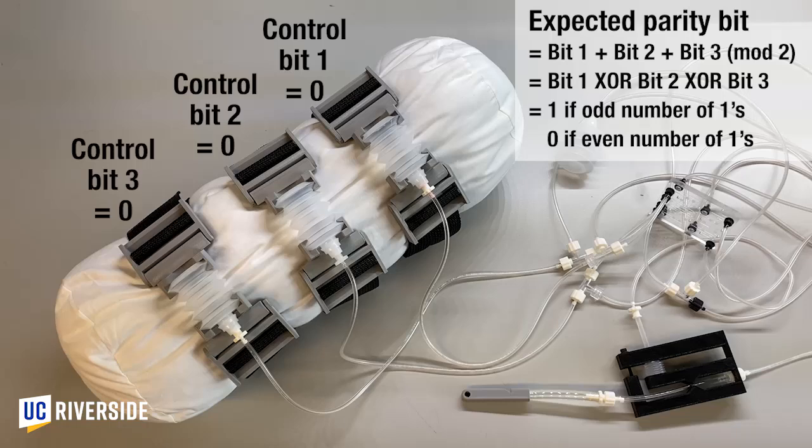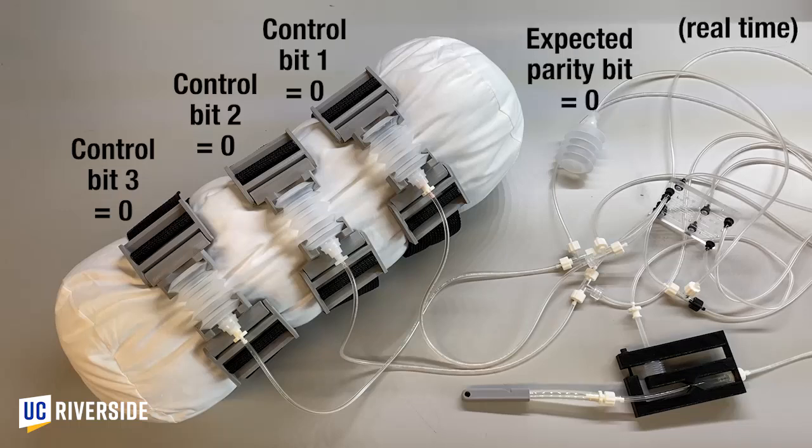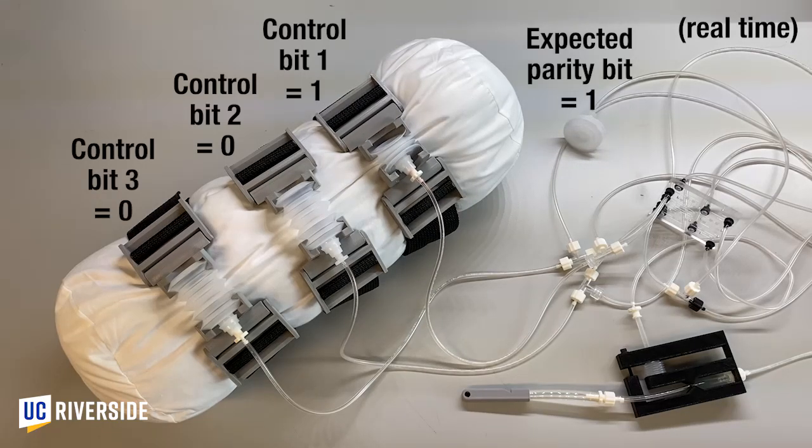We added a 4th bellows, shown here, to visualize the value of the expected parity bit during operation. When none of the IPC bellows are receiving vacuum, their control bits are all 0, so the expected parity bit is also 0. When control bit 1 is under vacuum, or 1, that means that the sum of the control bits is 1, and 1 is an odd number, so the expected parity bit is 1, and we see its bellows contract under vacuum.